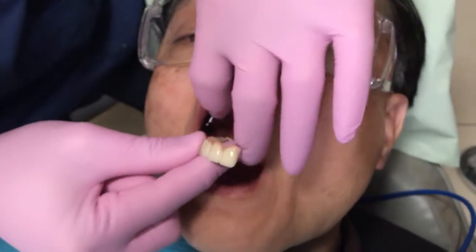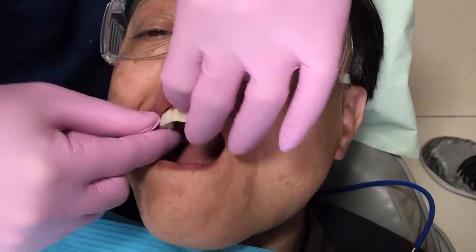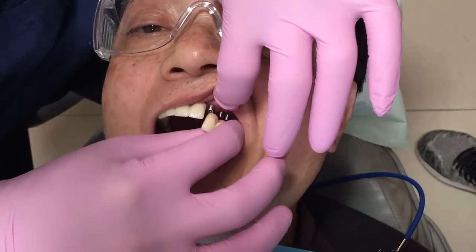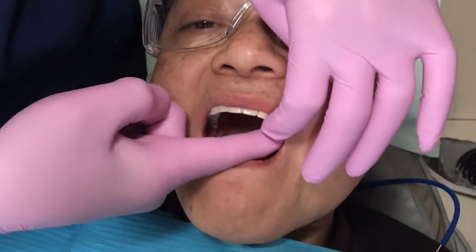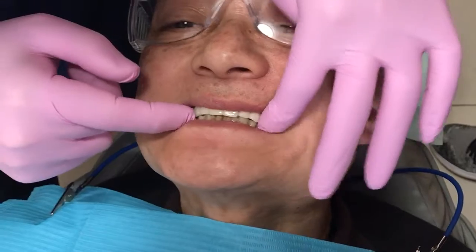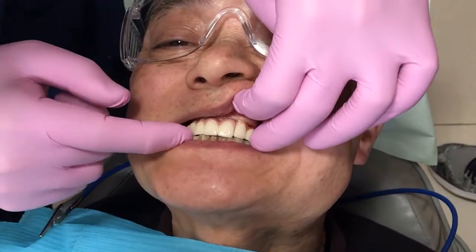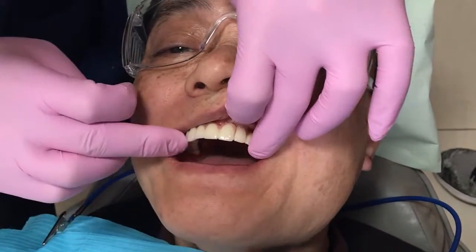Those are the implants. This is the teeth — we will see them later but we will try it now.